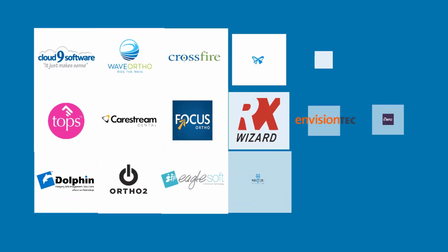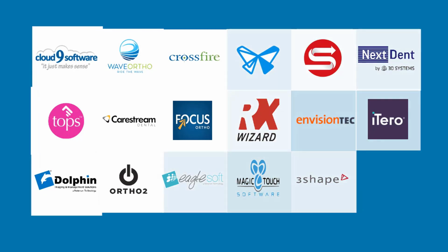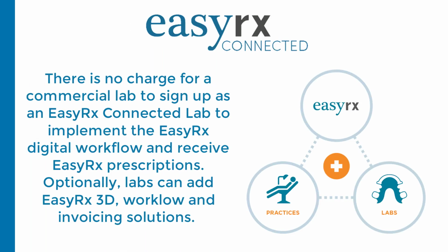EasyRx integrates with a number of different softwares. These include practice management, lab management, treatment planning, intraoral scanners, and 3D printers. And this list of integrations is always growing. We want your digital workflow to truly be as easy as possible, which is also why we make inviting your commercial labs to use EasyRx so easy.